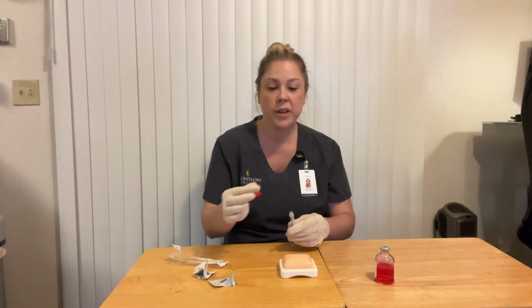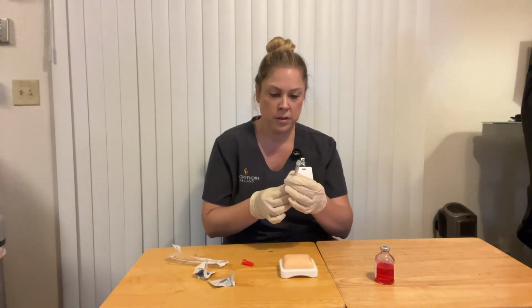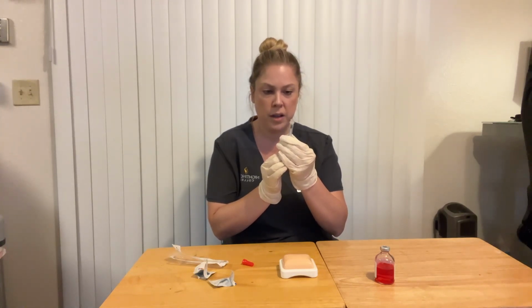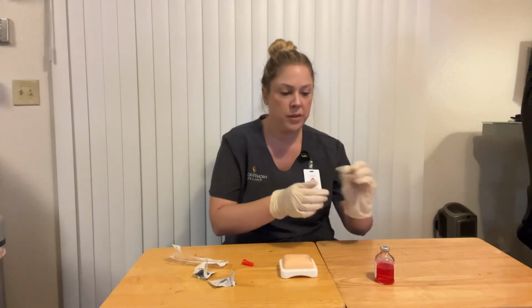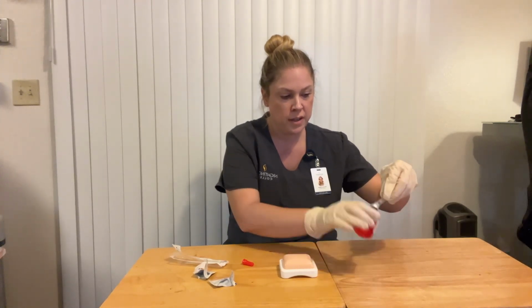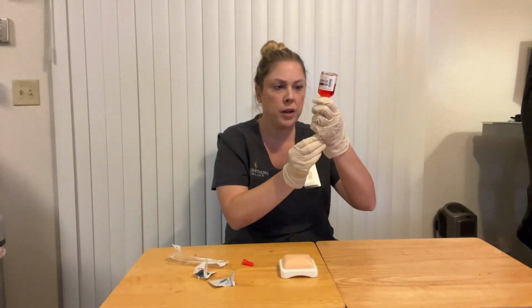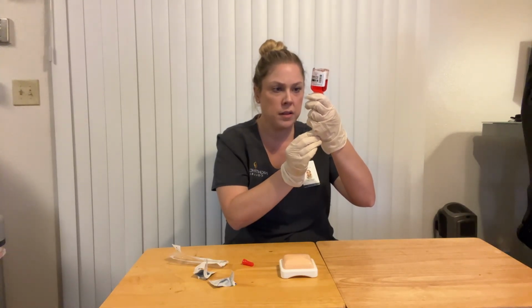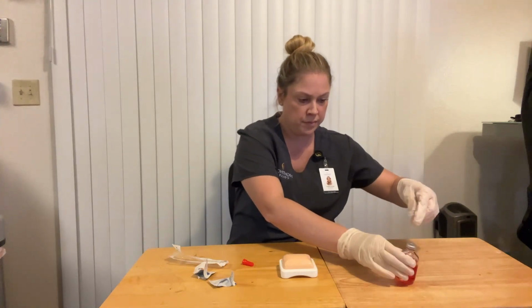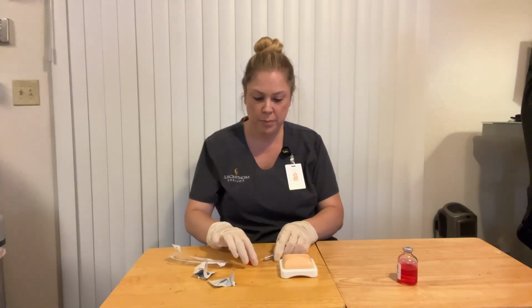I would safely remove the cap and pull down 0.1 mLs of air. I would then insert that air into the medication vial. Then I would withdraw 0.1 mLs of medication. Safely recap that.